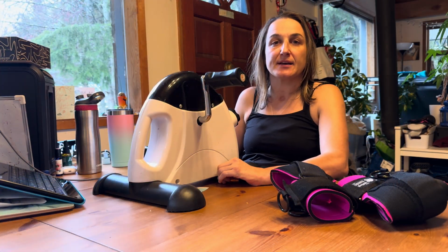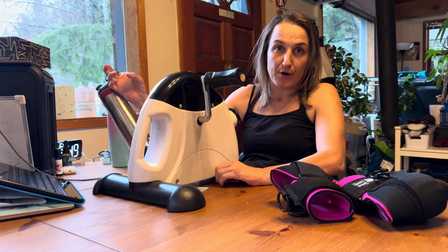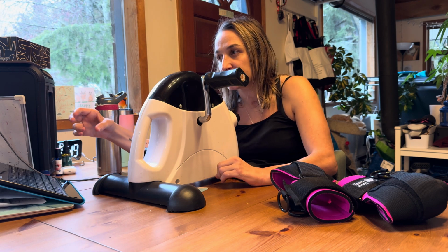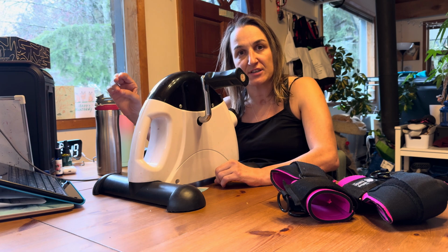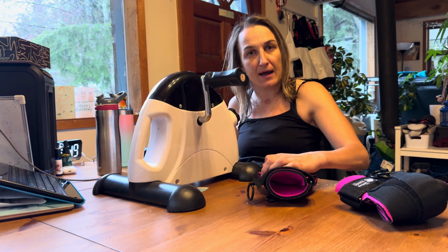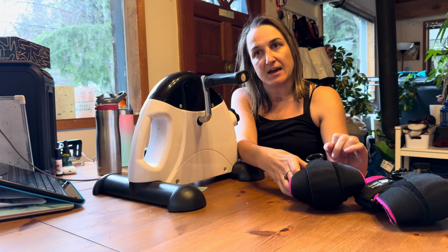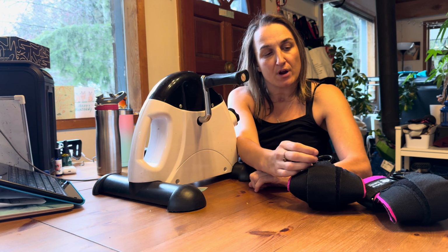Okay, so once the bike is on the table, I'll make sure that I have my water, and also that my iPad is there, and whatever I want to watch, or if I'm going to follow a spin class or something, that it's ready to go, so I can just press start before I start putting my hands onto the handle. And then I'll make sure that I also have my active hands to be able to hold the handles. So before I put these on, what I found with the active hands is that it's always good to go a size over. I'm usually a small, but I would go for a medium.